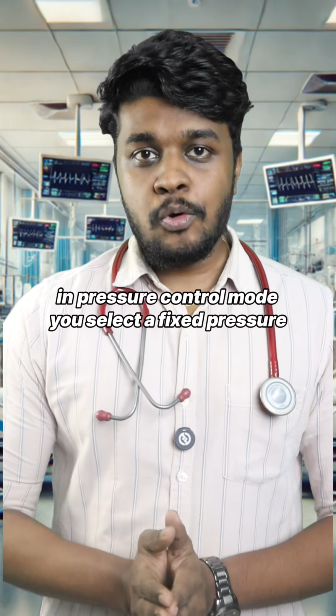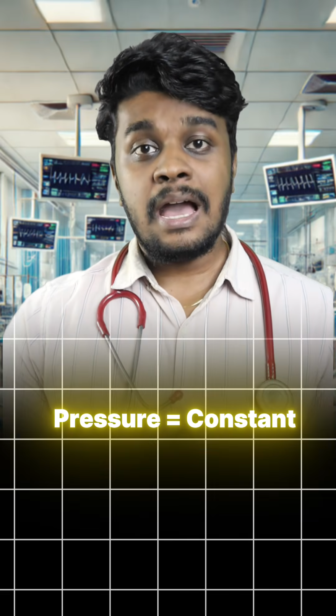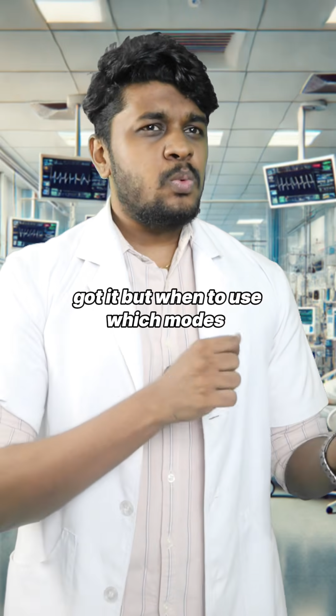Whereas in pressure control mode, you select a fixed pressure that should be delivered to the patient. So here, the pressure will be constant. However, the amount of air that will be delivered will vary. Okay, got it, but when to use which modes?